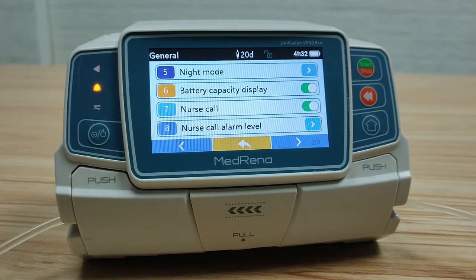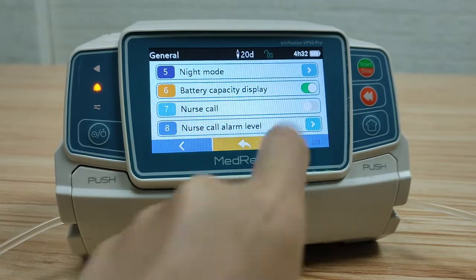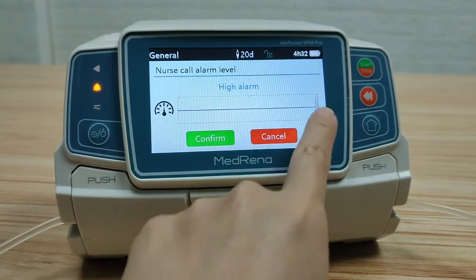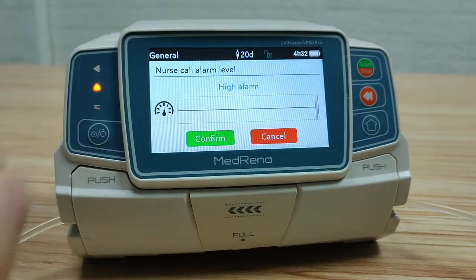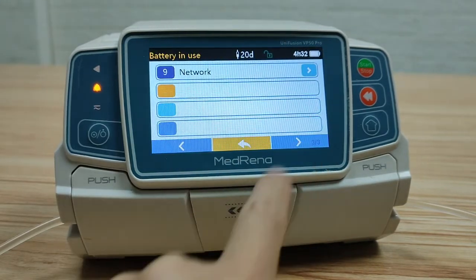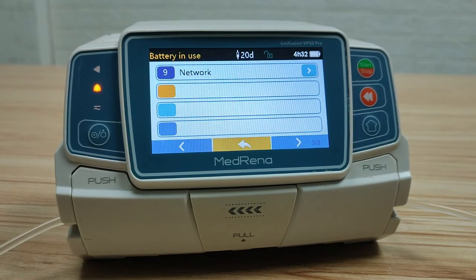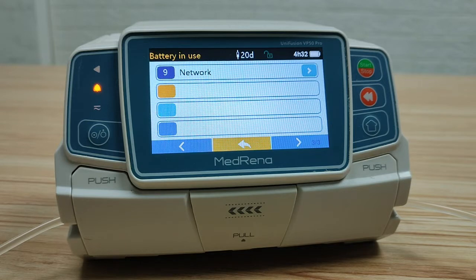Nurse call: choose on where this function is needed; there are three alarm levels for choosing. Network: this is for setting the connection between the pump and other pump docking stations or an infusion management system. We have detailed instructions about network connection — please contact us if required.